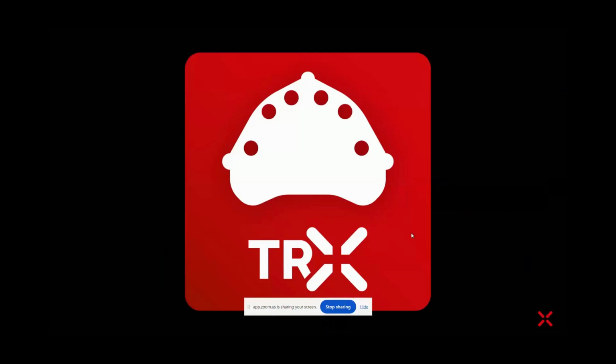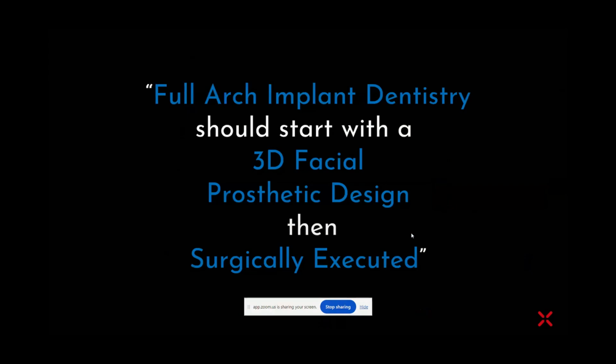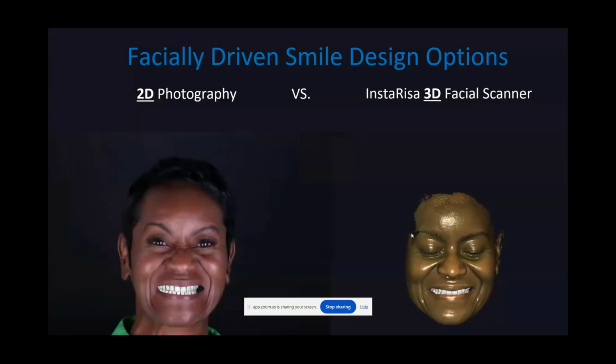One of the things that I noticed when I was lecturing in Italy earlier this summer is everyone questioned as to why we weren't facially driven. So in the last year, I purchased a facial scanner from my friend Art Morellis at Instarisa, and I've become more and more 3D driven. So instead of using photographs for a lot of our pre-op records, we use 3D facial scans to get our smile design, prosthetic design, and then we surgically execute this.